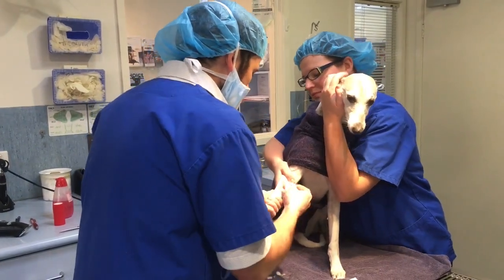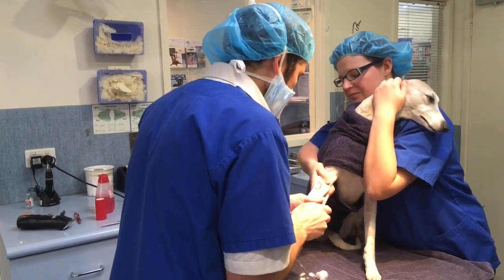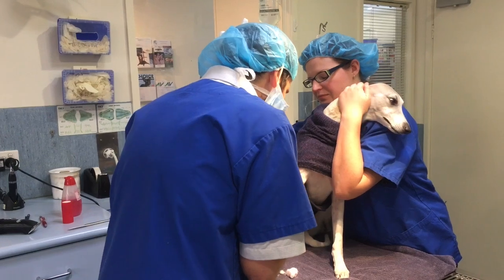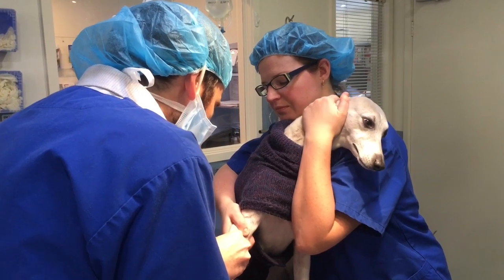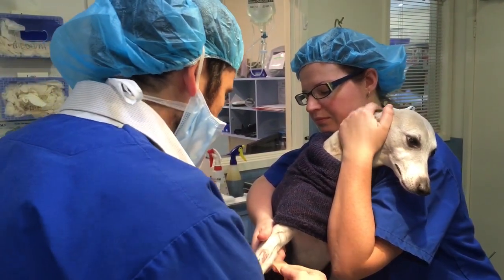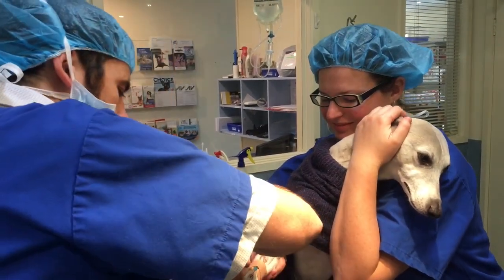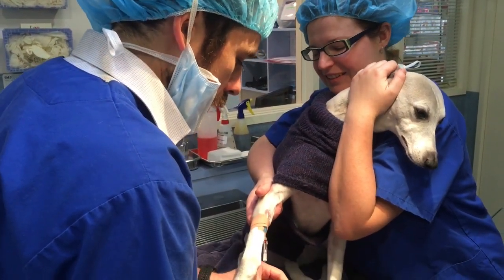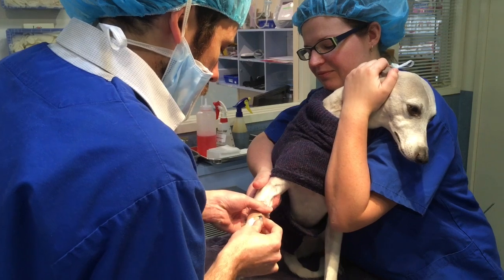Sarah's just holding that vein up for me, so that's just sitting up there on the front of Rosie's leg. We pop the catheter in — it's the tiniest little pinprick that they feel. And that's the painful part done. We tape it in, because it's always heartbreaking once you get the catheter in and then the dog moves and the catheter comes out. Now I need to do it again. Thankfully that hasn't happened on the video. Pop a little injection port in.